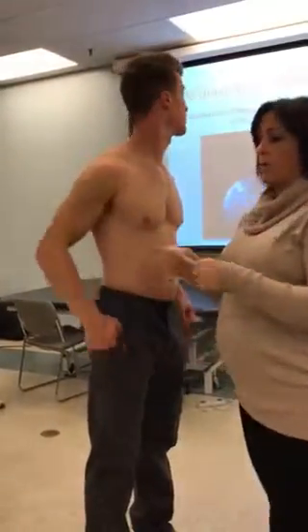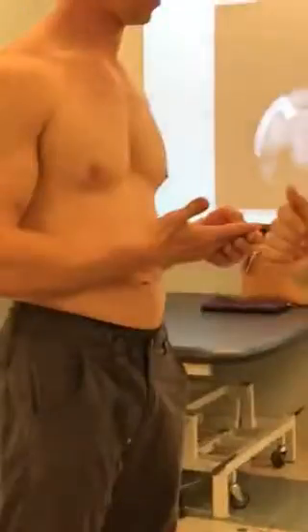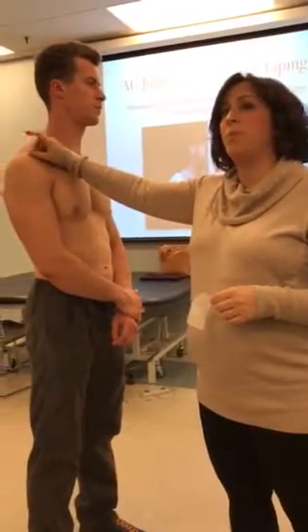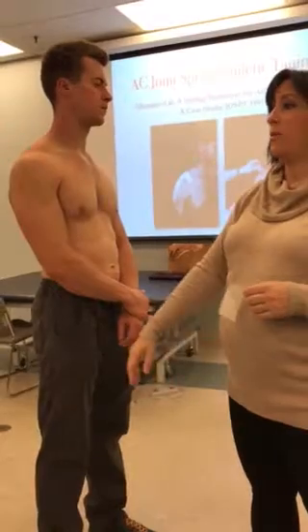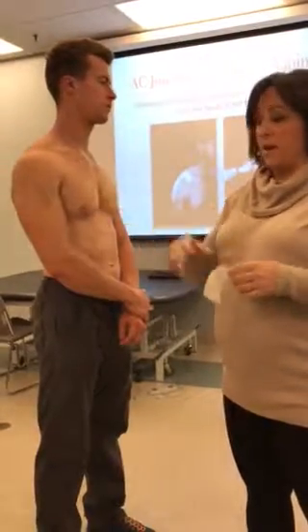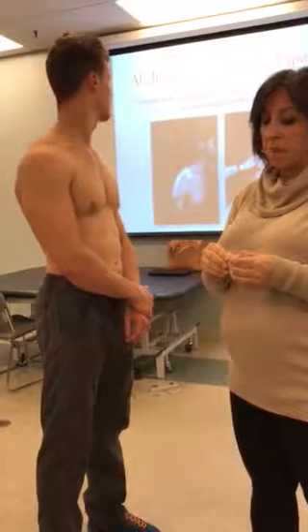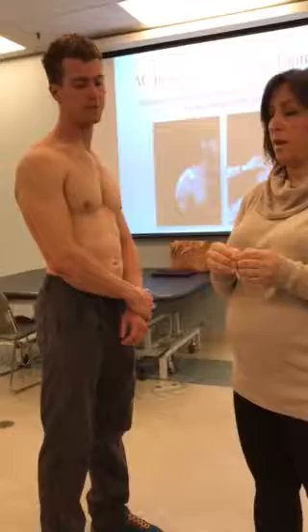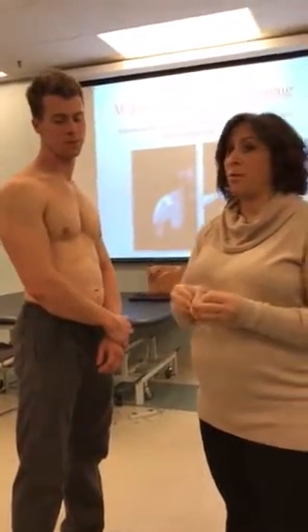You're on the sideline, somebody comes off, they have an immediate AC joint sprain. You're the person that's there. You see a potential step deformity and/or just a lot of pain with motion in the shoulder. The athlete potentially is going to go back into play, but hopefully not, especially if you see a step deformity. But you want to stabilize that shoulder quickly.